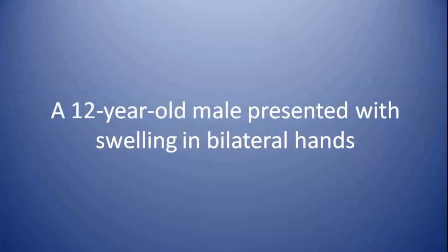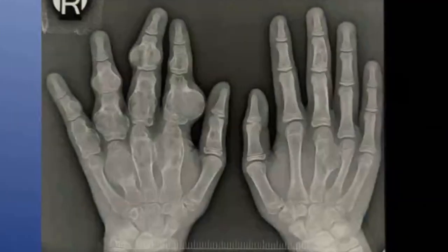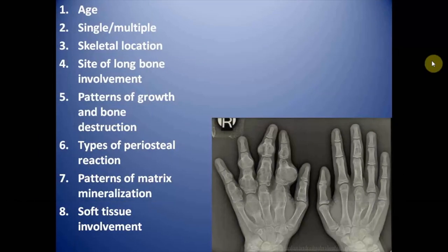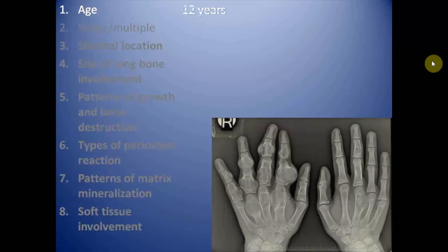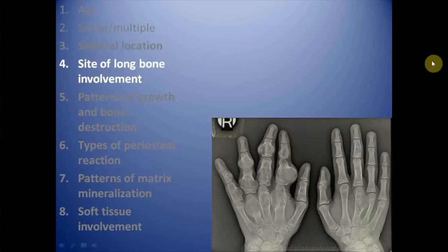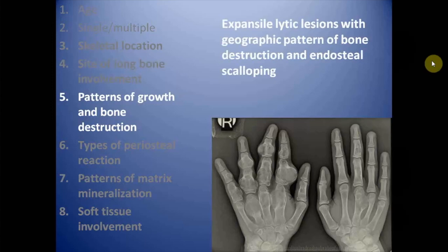McCune-Albright syndrome represents polyostotic fibrous dysplasia with skin pigmentation and precocious puberty. This is the case of a 12-year-old male who presented with swelling in bilateral hands. This is the AP radiograph of bilateral hands of the patient. Age is 12 years — a skeletally immature patient. The lesions are multiple. Skeletal location is the appendicular skeleton involving small bones of the hands. The site of involvement is metadiaphyseal. The lesions are expansile lytic lesions with geographic pattern of bone destruction and endosteal scalloping.